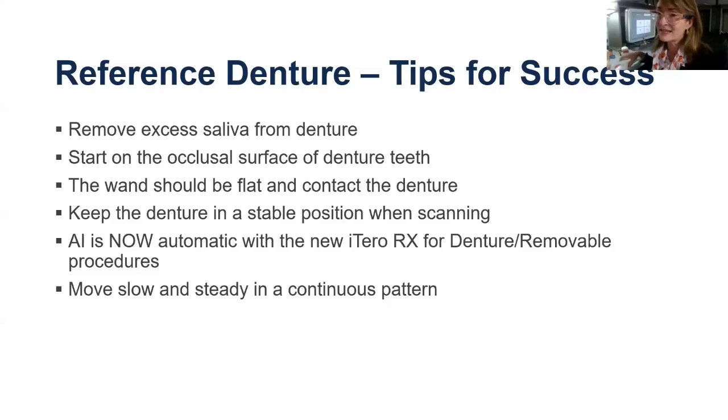Many people have asked, and I have tried, can you put the denture on a countertop and scan it that way? I have not had success in doing that. I've tried to even use something like sticky tack to hold the denture in place, and that did not work well in my hands. It is important to go slow and steady and be very methodical in your scanning.